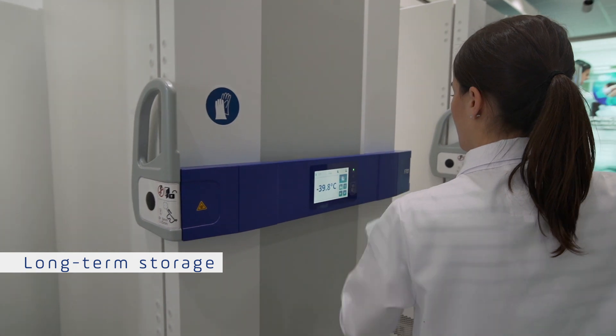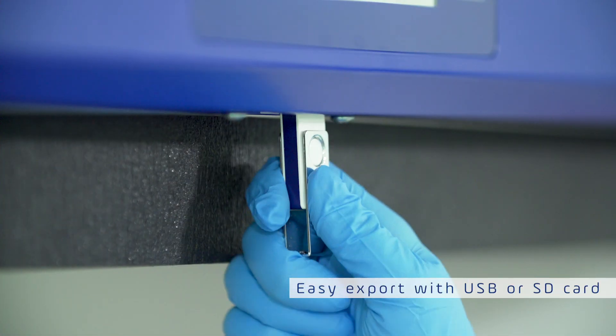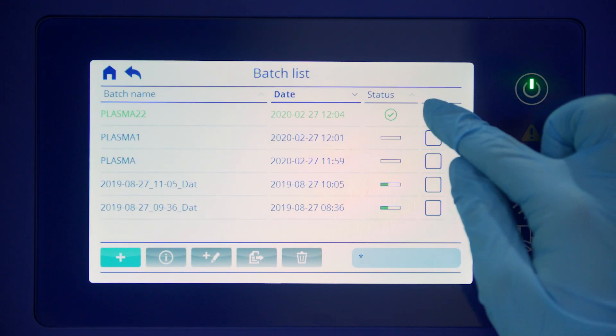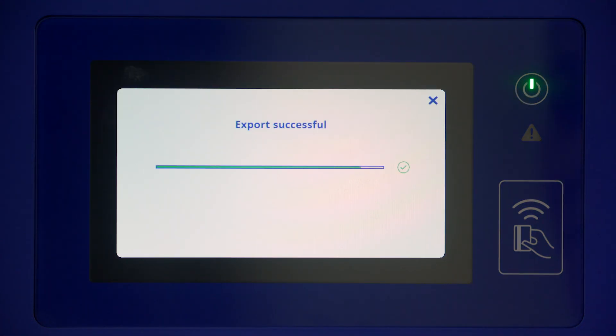Store your bags in a reliable plasma storage freezer free of frost until required for transfusion. For your records, you can export all data manually or generate reports on your computer, tablet, or cell phone via the B Medical Systems B Connected solution.